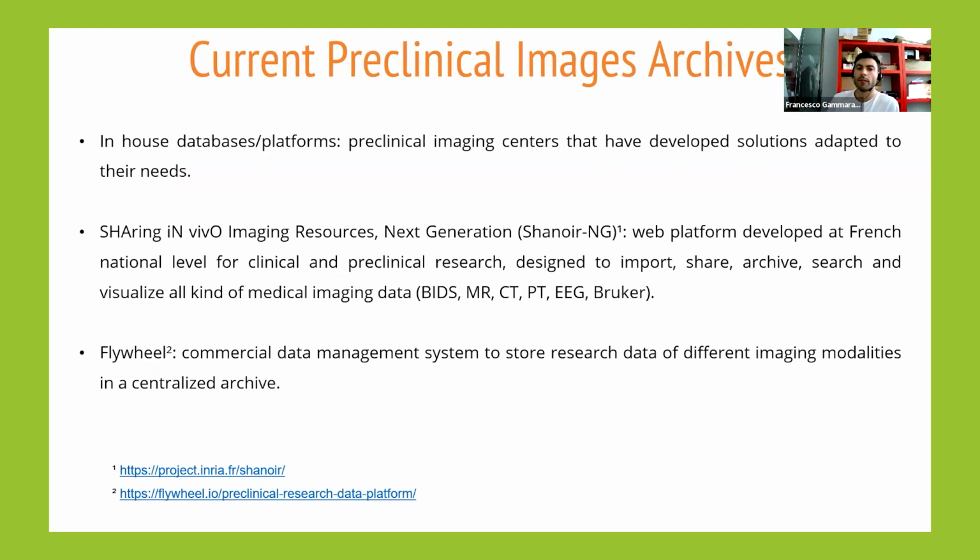At preclinical level, we have different archives for storing and sharing images. For example, we can have in-house databases or platforms that the IT staff can develop. And then we have Shanoir, that is a web platform developed at French national level for clinical and preclinical research, for importing, sharing, searching, and visualizing medical imaging data. And there is Flywheel, that is a commercial data management system. So we don't have a solution for our needs.